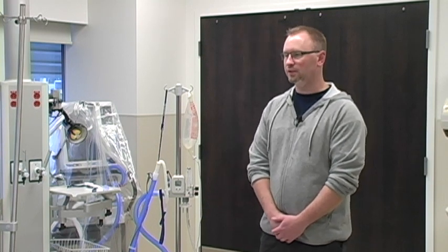One of the first questions I get about it typically is, what are we replacing with the Optiflow? Really, here at Royal Inland Hospital, we're not replacing anything. If you think about the oxygen therapy that we provide our patients now, starting at nasal prongs, going to a simple mask, then a high-flow aerosol device, the next thing that we can provide our patient, if they need more, is BiPAP. So this Optiflow is going to fit in that gap between BiPAP and high-flow aerosol therapy that we give now.